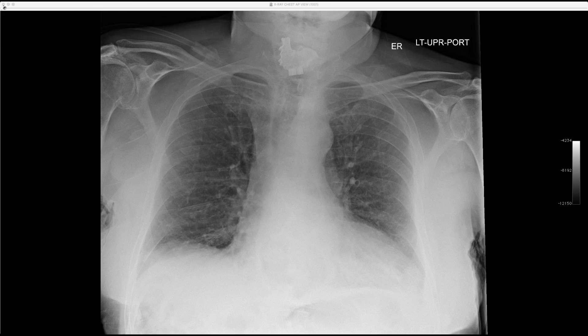For fun, the presenter shows a foreign body case — aspirated dentures visible on imaging. A colleague noted the shape looked like the state of Wisconsin, but the presenter preferred the alternative interpretation: it looks like a rooster. The bridge and individual teeth are identifiable.